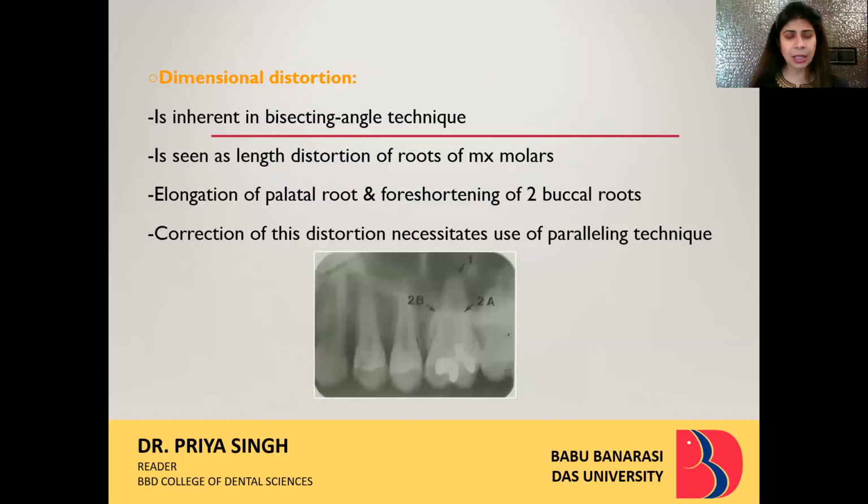Dimensional distortion is inherent in the bisecting angle technique, which we can eradicate when we are doing intraoral radiography by the paralleling technique. That is why paralleling is said to be the standard technique, but being an easier technique which can be advised in almost all patients, bisecting is what is usually followed. So you should know beforehand how to minimize this dimensional distortion in the bisecting angle technique.